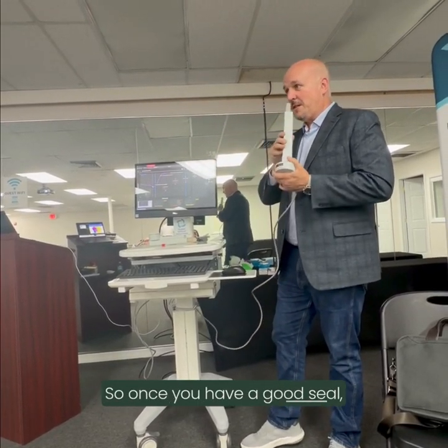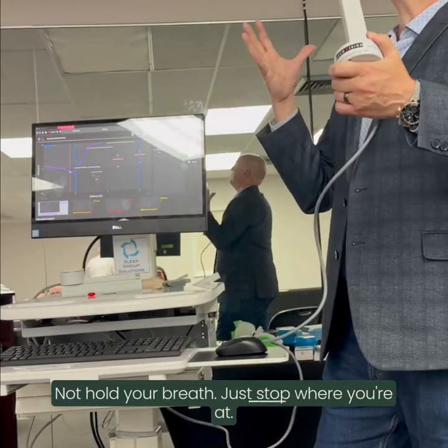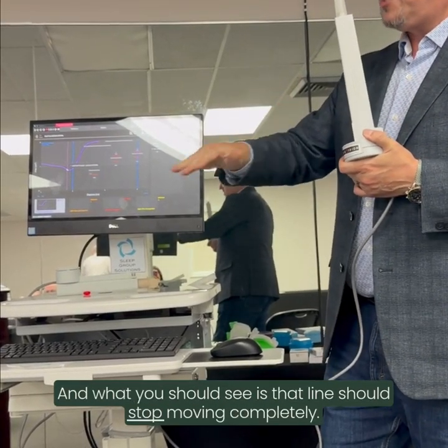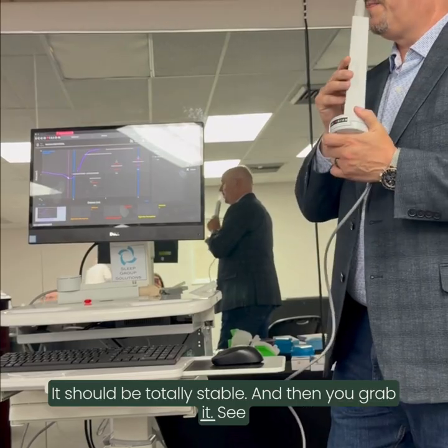So once you have a good seal, we tell the patient to pause breathing, not hold your breath, just stop where you're at. And what you should see is that line should stop moving completely. It should be totally stable. And then you grab it.